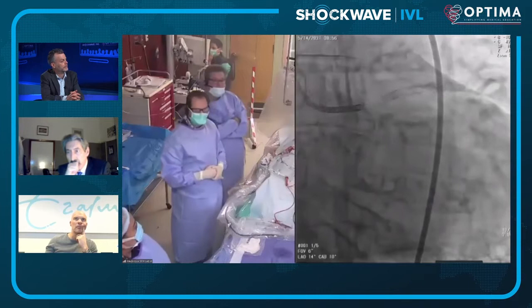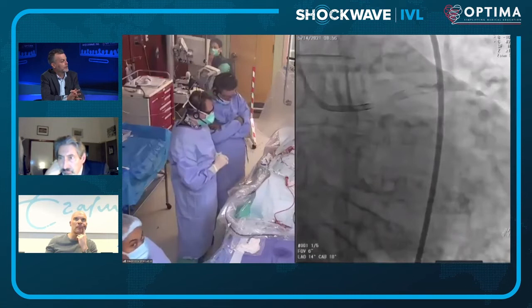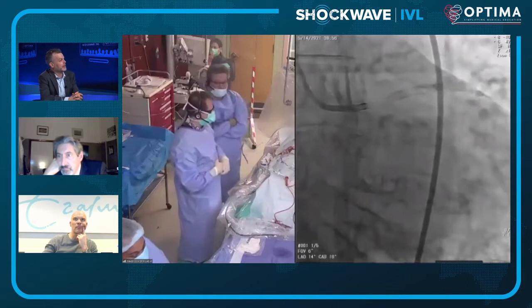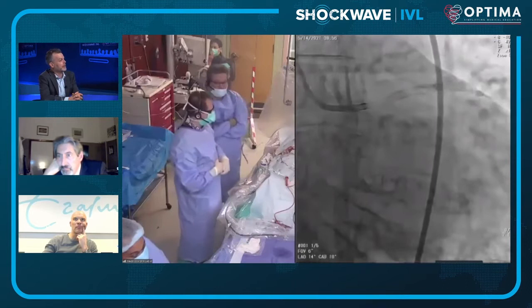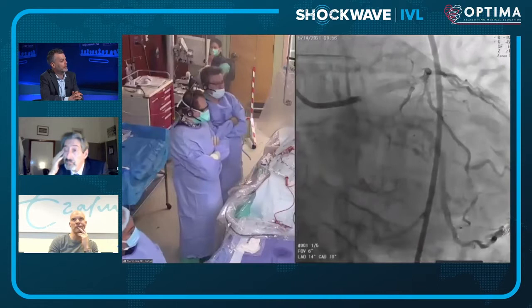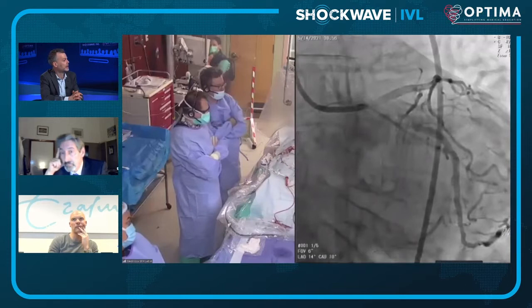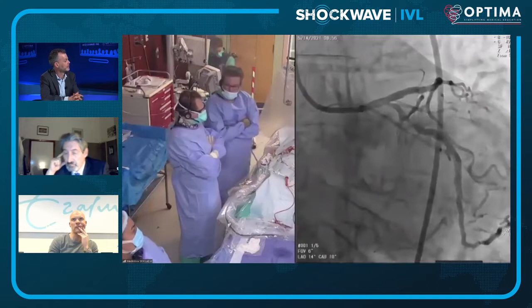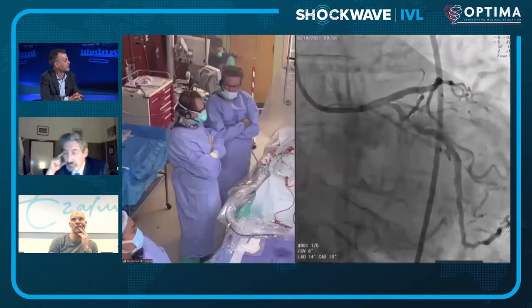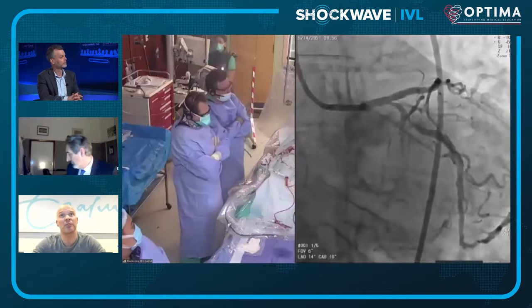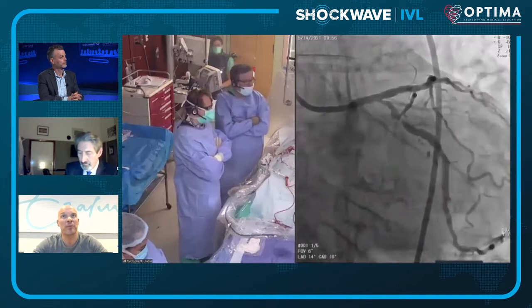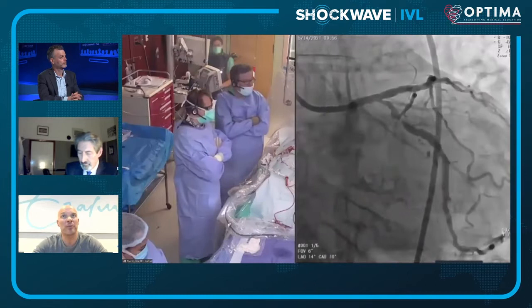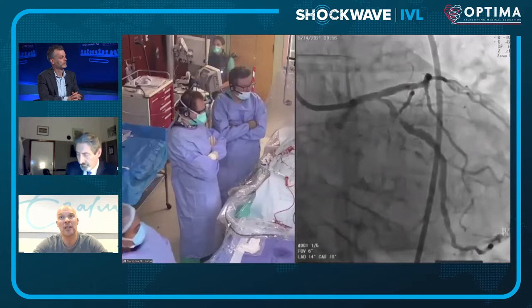James asks Nicholas about goals of therapy for this elderly gentleman with previous revascularization, a dominant circumflex, and subtotal occlusion into the left PDA. Nicholas: The primary target would be the tandem lesion in the proximal segment, from the ostium of the circumflex going 20-25 mm into the vessel. He would not waste too much time and contrast on the posterolateral branch distally, and agrees with an imaging-first strategy using OCT to refine the strategy given the armamentarium of calcium modification options.